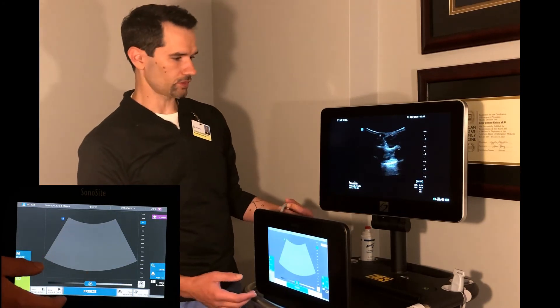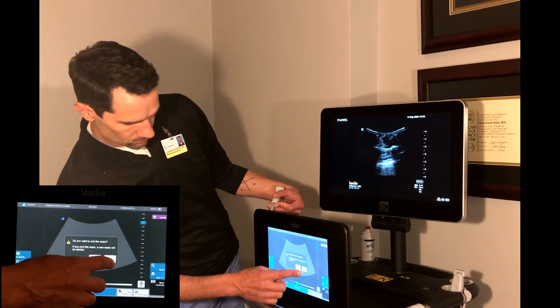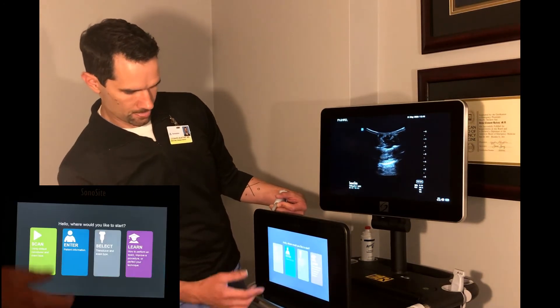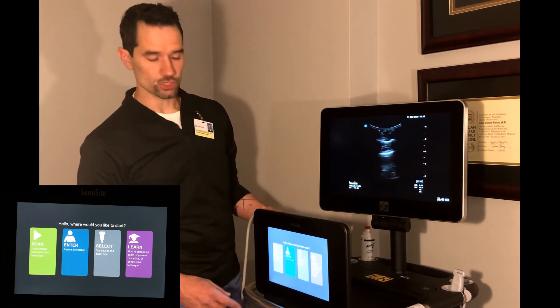When you're complete with your exam, just hit the end exam key. Just make sure you end your exam each time. Hit yes, and there you're back to your general screen. Pretty easy to use.